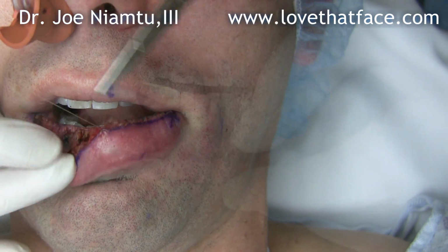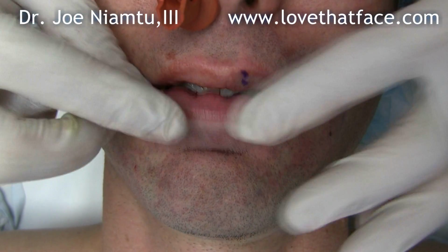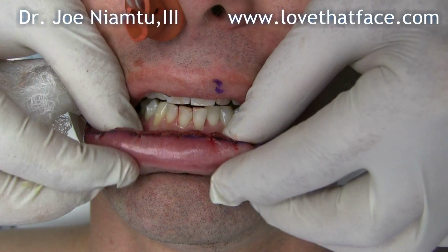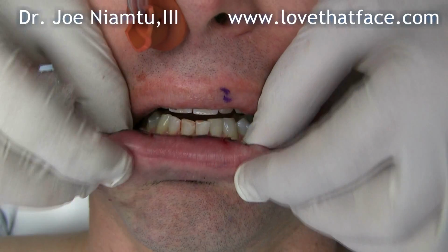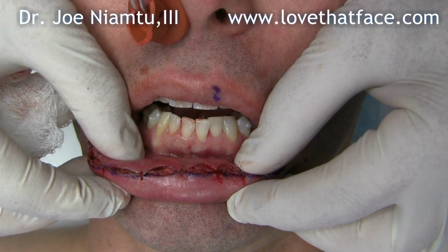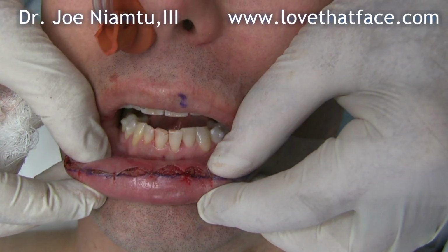Now we put our key sutures in, and this just helps line up the mucosa, and it's going to turn the lip in. And because of the swelling and the local, there's a little bit more art than science at this point, but generally, if you've measured it correctly and have a symmetric outline, it should pull everything back nice in a very symmetric manner. So we'll go ahead and put our final 6/0 silk closure in, and then we're done.